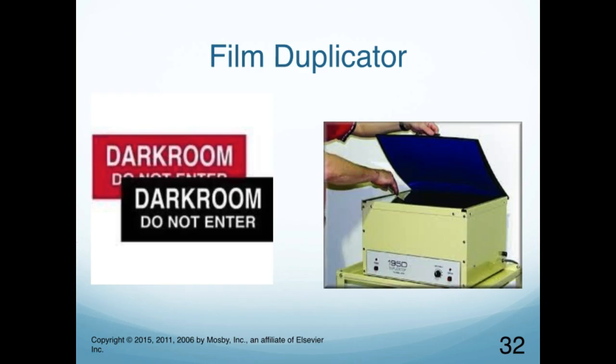So here it is. Here's the film duplicator. You would basically put your already exposed film that has an image on it, and then you would put a fresh film on top of it, lay that flap down, and set it for a certain amount of time, and it would basically duplicate the film, and we would process that other film, and we'd have duplicates of each other. Amazing technology.